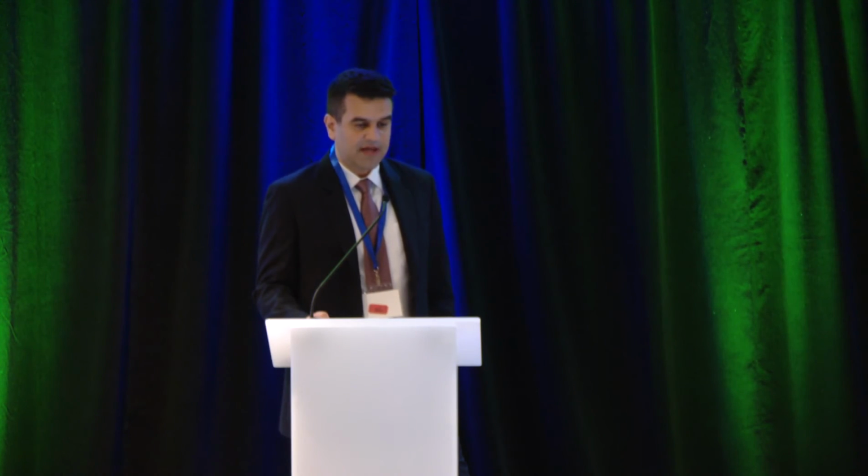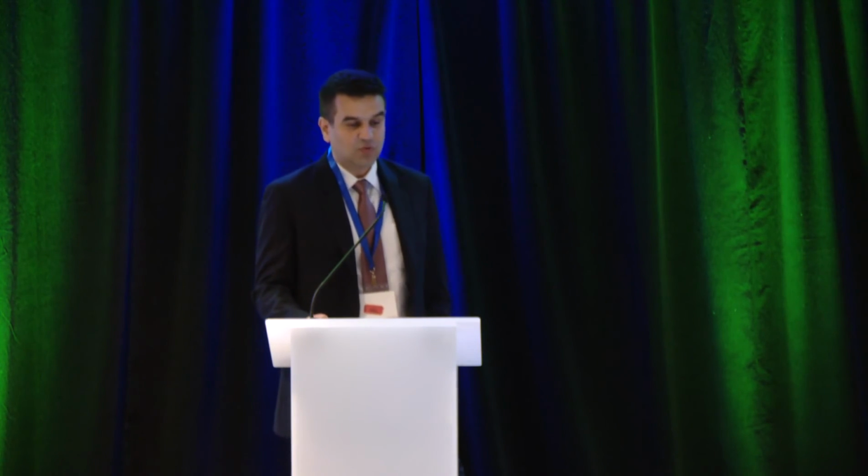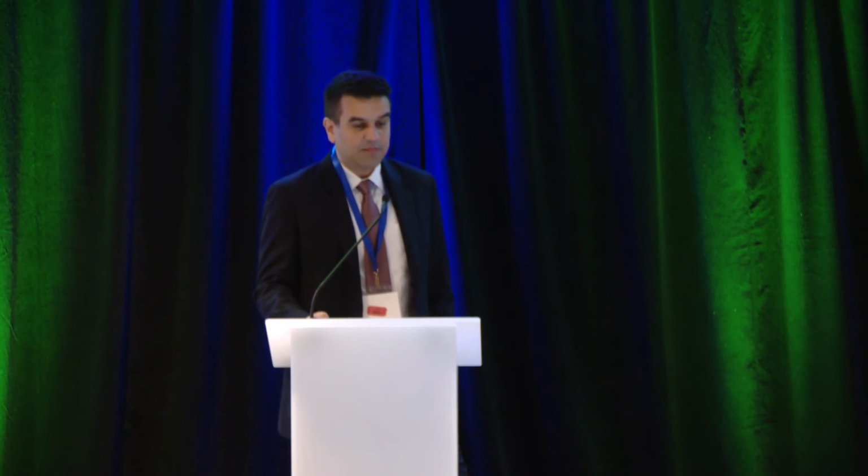Now, going down the hierarchical classification scheme, what happens if you don't have 100% failed peristalsis and you do have a normal IRP and you have at least 20% swallows with premature contractions? That would be distal esophageal spasm.